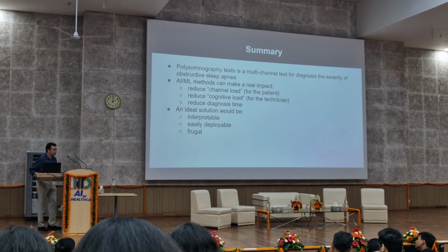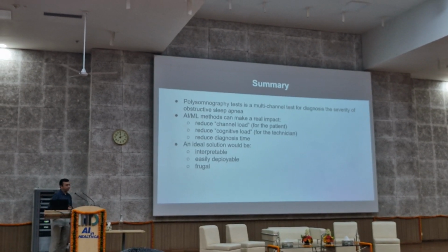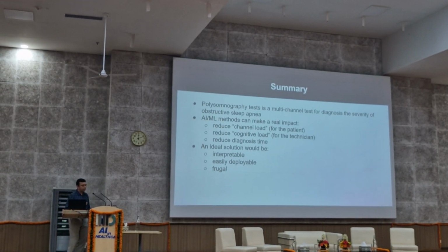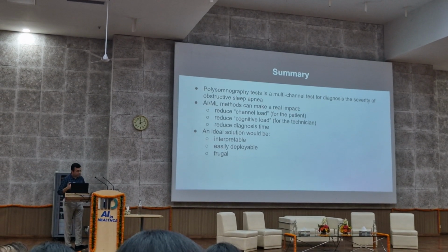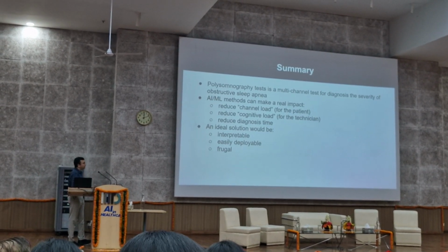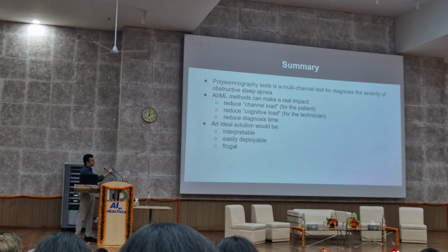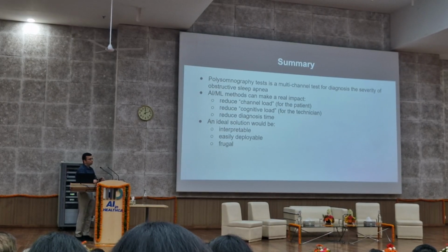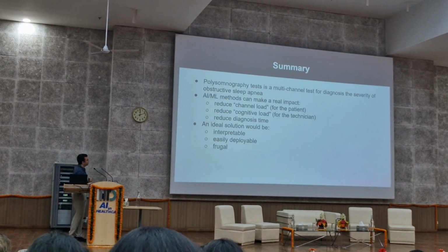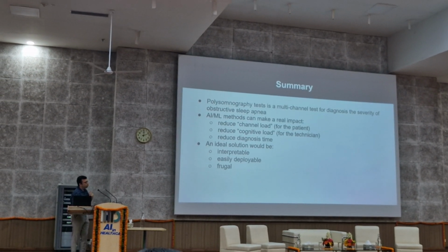Okay, so I'll end it here by summarizing that the polysomnography test is a gold standard test. We have to think about what exactly we are measuring, which are these important channels. And with Dr. Anurag, we had a discussion, and he pointed out that we can think of this from a different point of view, a technological endpoint, where rather than having this instrument measure everything, you can probably have things measured from your watch, something like a watch that I'm currently wearing.